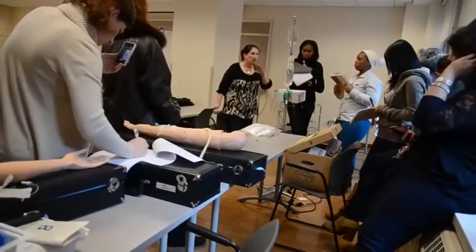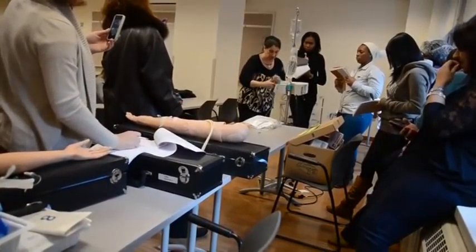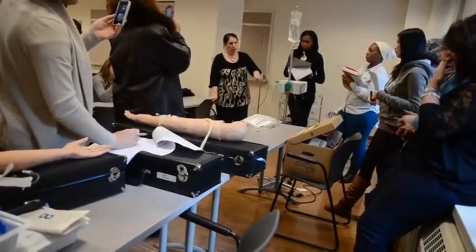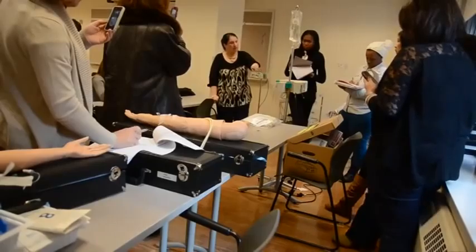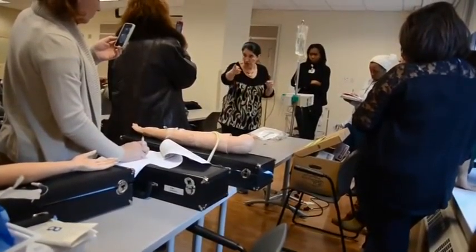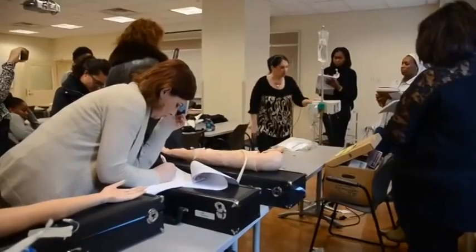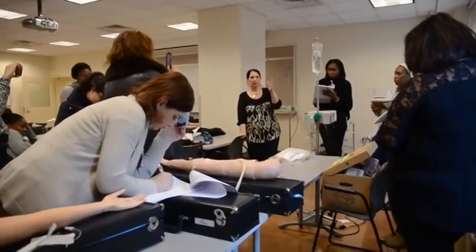Then when it's done, I come back in and just disconnect it. I'm going to put my IV bag back up, and I just want to make sure that this pump went back to what it was before. So if it was 50cc's, I have to make sure that it says 50 and not the 100 that I put in. Each time you do this, you're coming in, you're checking the patient, checking your checklist. Make sure you check the site — everything you need to know is in the learning packet.